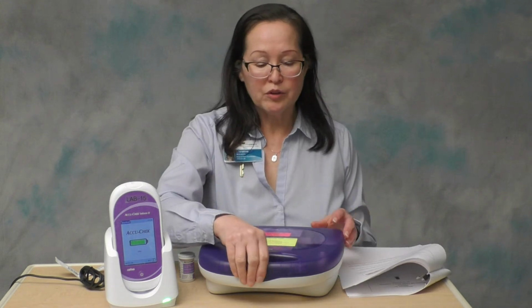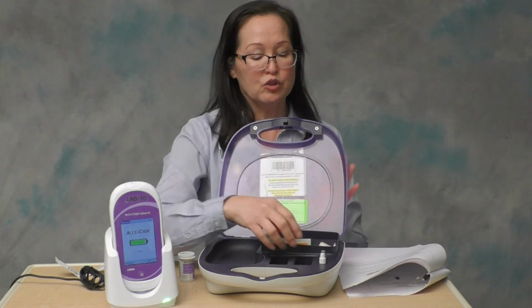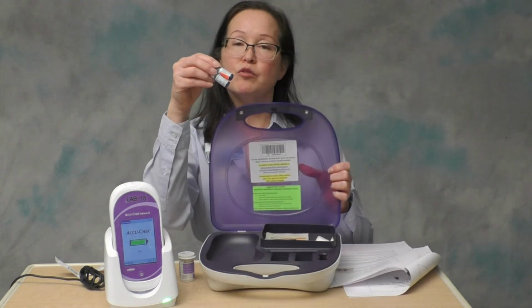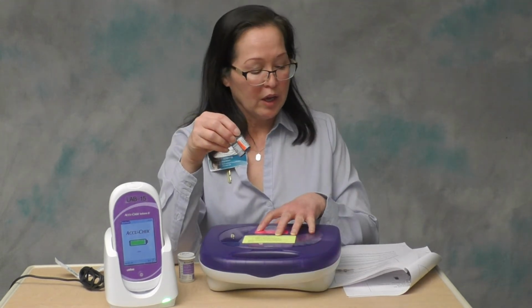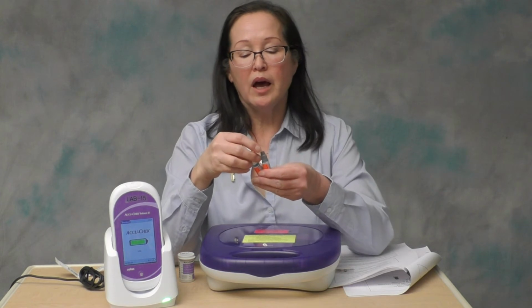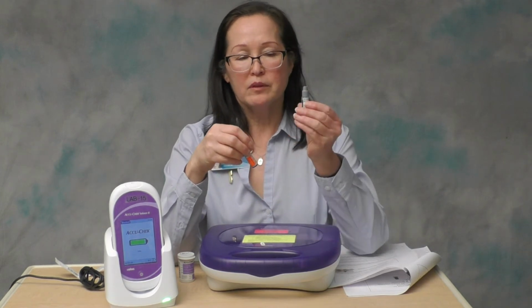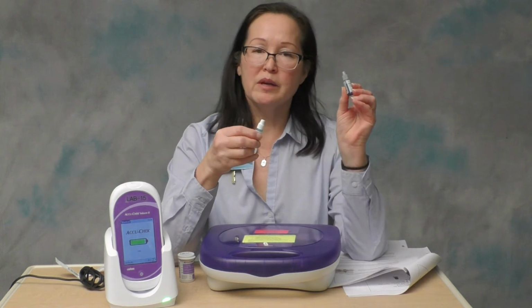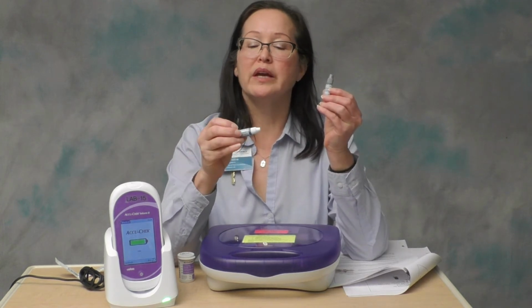Now we will cover the quality control solutions. So in the tote there'll be two little bottles of quality control solutions. We run a high and a low. Gray cap is the low, white cap is the high. The low will say number 1 on it, the high will say number 2 on it.